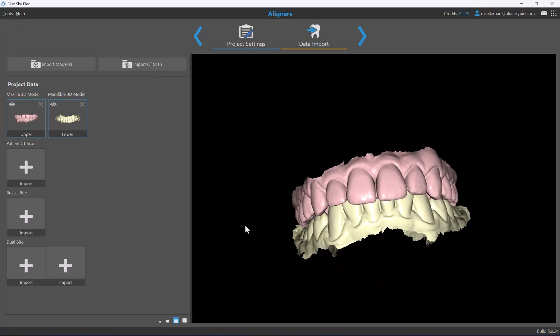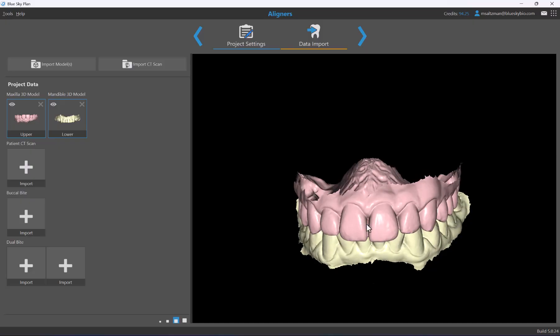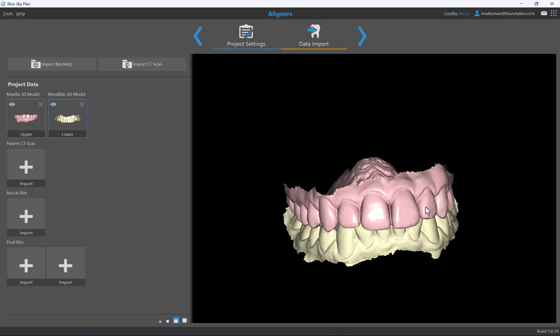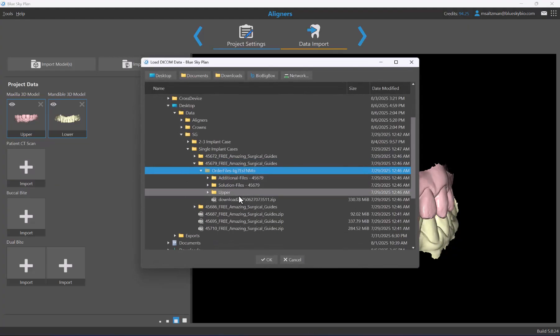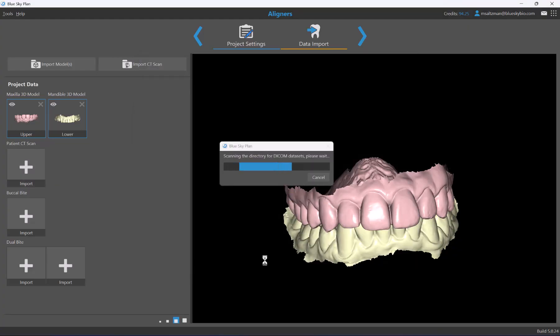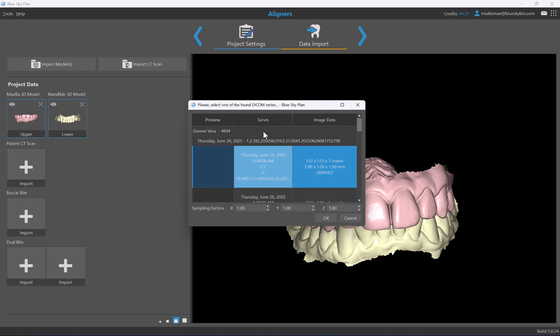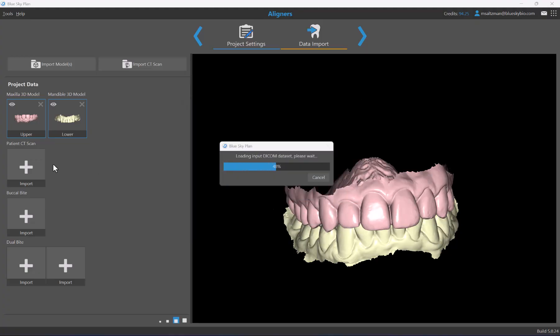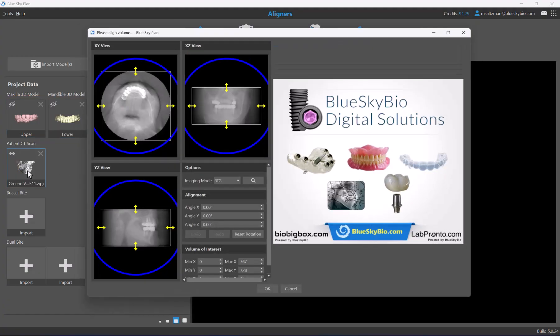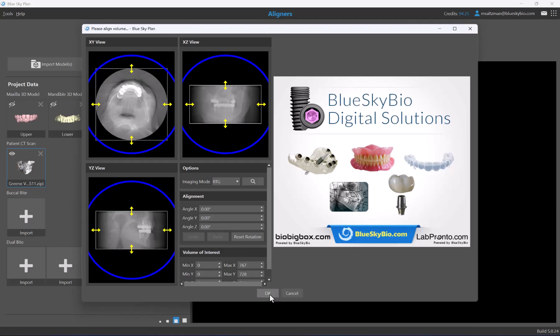If the models are in proper articulation and you don't need bites, click the red X to remove them. Even if the models appear to have been scanned in reverse, the orientation will be updated automatically by the software. The same applies if you import the patient CT scan — we highly recommend importing the CT scan because the software will automatically segment the teeth and provide the patient's true anatomy with complete tooth visibility.